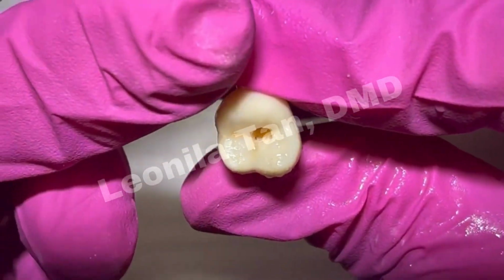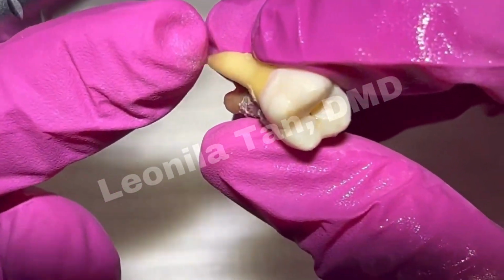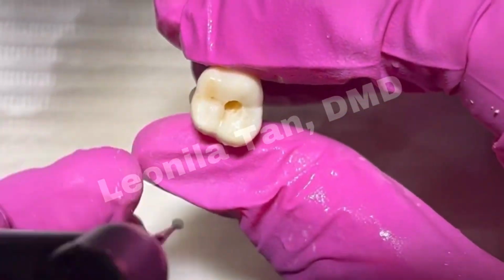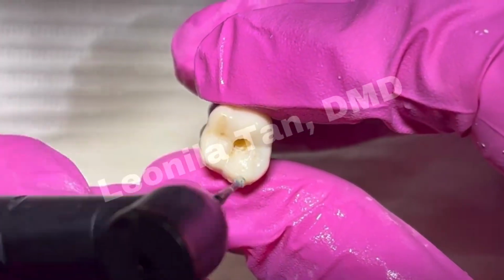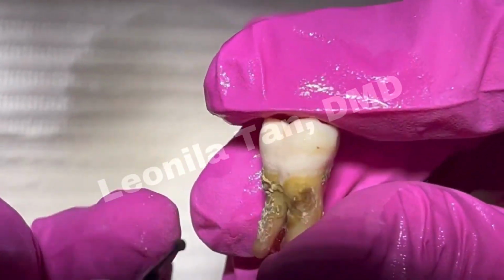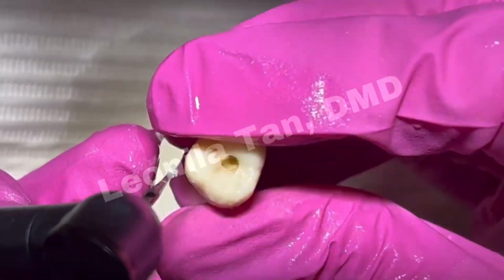Since you located the palatal canal already, you need to unroof or open the chamber toward the buccal side, because now you need to locate your buccal canals.